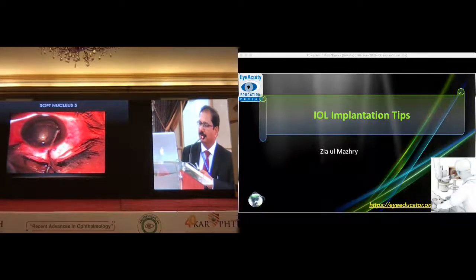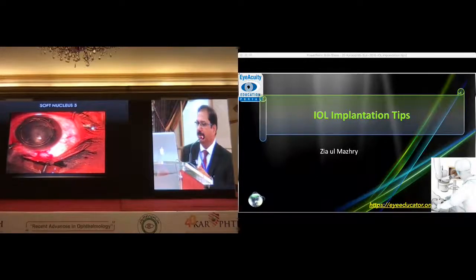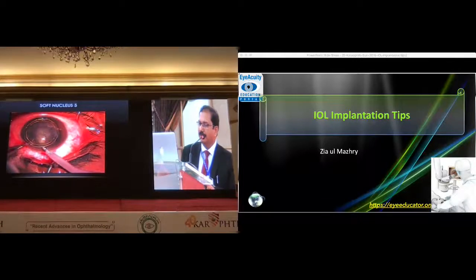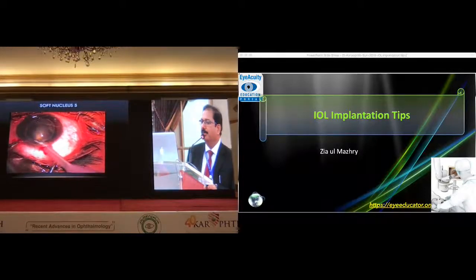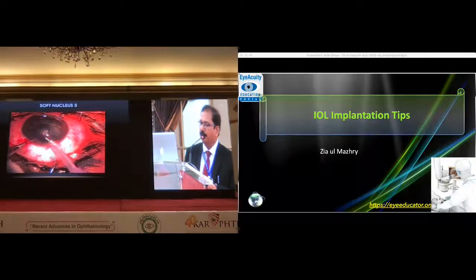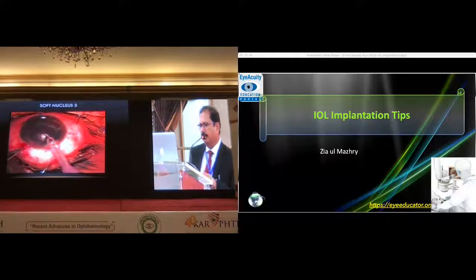This is actually hydrodissection — it's been done with hydrodissection. You can see this nucleus; it is very free. But it's a larger one, though you can still easily manage it. The parameters: the phaco power is very low — you can keep it up to 20. You don't require too much power. The vacuum is about 400 to 450. We just try to remain in the center and stay central.